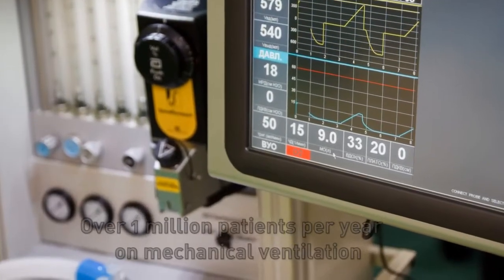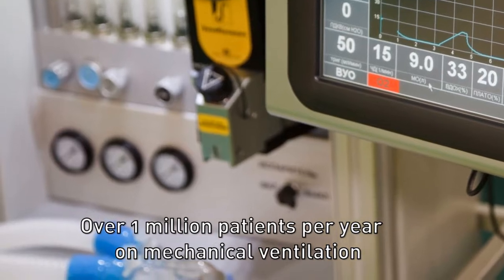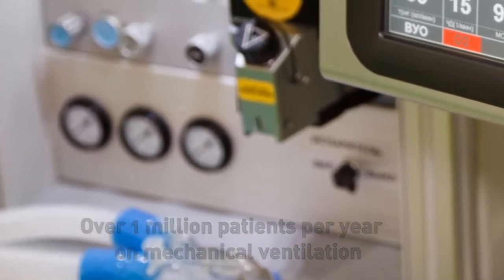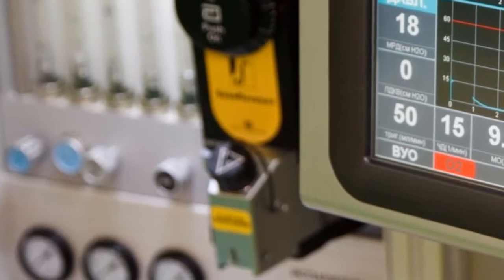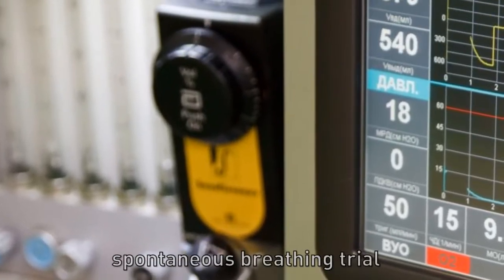Every year in the US alone, over 1 million patients in the ICU are on mechanical ventilation, and one of the most challenging decisions faced by clinicians is the determination of when a patient is ready to be weaned off the ventilator. Today, a clinician will dial down the airflow and observe the patient for 30 minutes, conducting what is termed a spontaneous breathing trial.